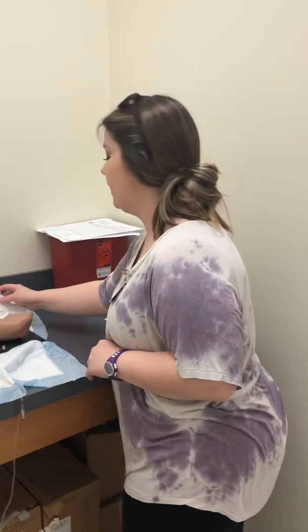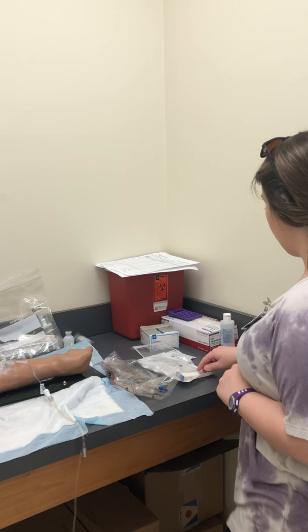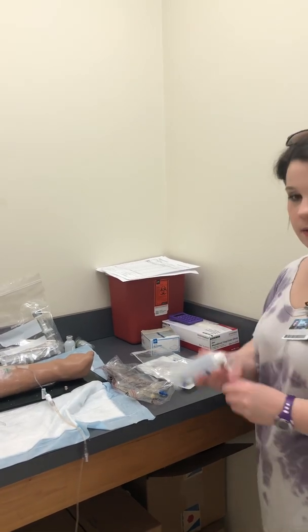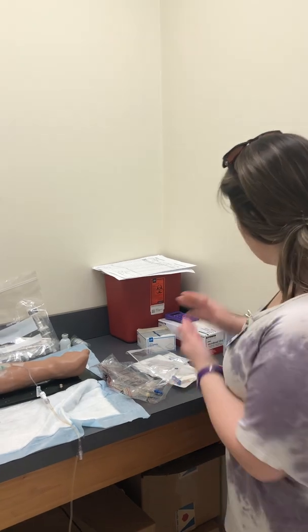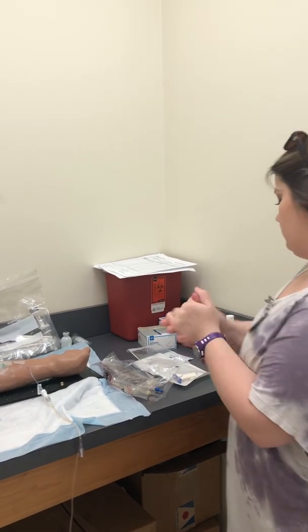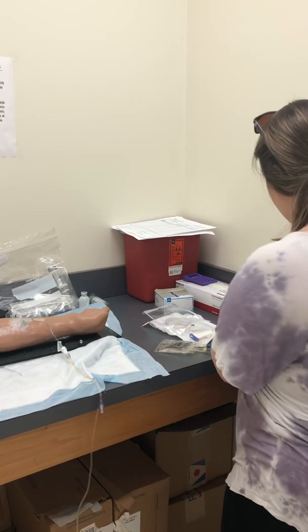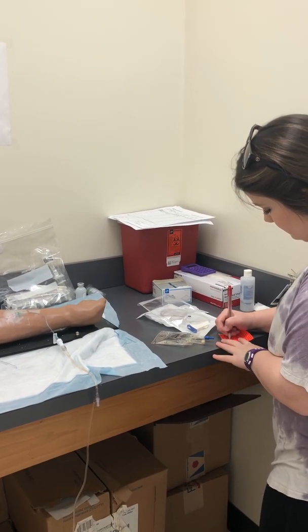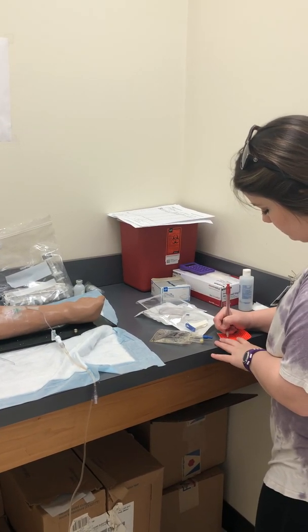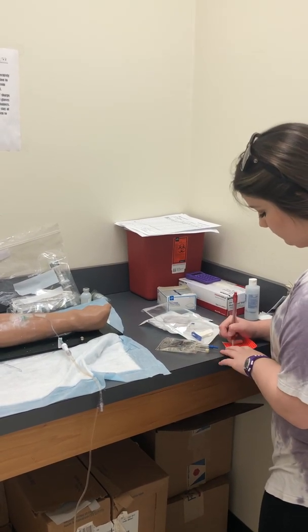Alright, I'm going to gather my equipment. I'm gathering my equipment. I'm going to wash my hands. Okay. I'm going to label my solution. It says here I have 50 milliliters of D5, so I know that is correct.